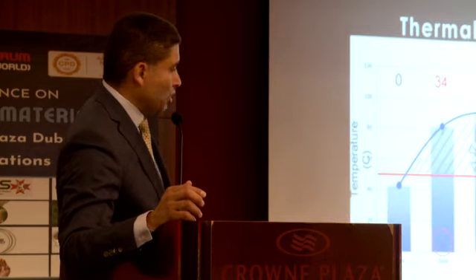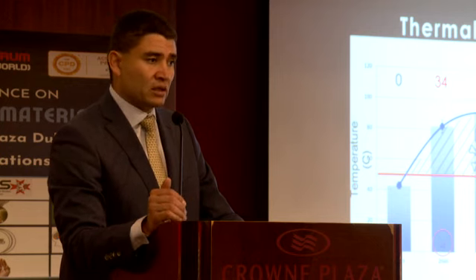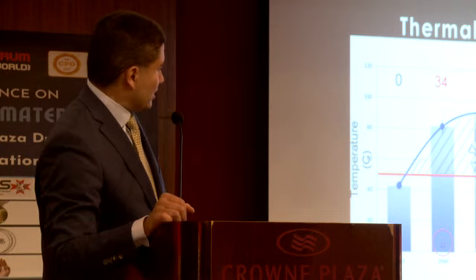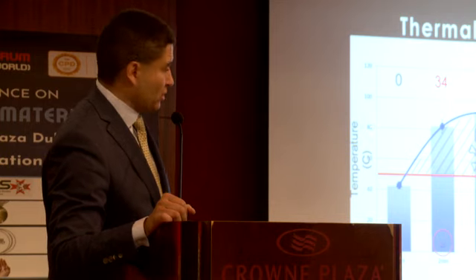And we saw that 4 of the major implant systems in the market, and when I say the major implant systems, you know the brand names, I don't have to tell you the brand names. We tested all the major brands of implant systems in the market, and every single brand generated temperatures above 80 to 100 degrees Celsius, okay?